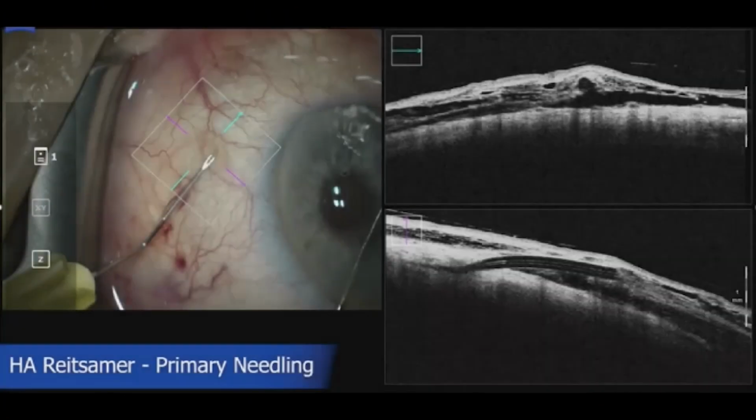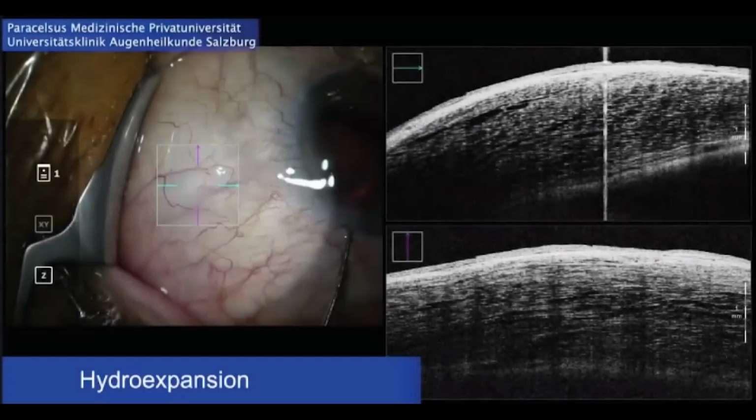Hence, primary needling, opening the conjunctiva, or whatever method you will use to create this space is the ideal way to ensure that the implant is free and mobile and out of Tenon's, ensuring the implant outflow will not be restricted by tissue.